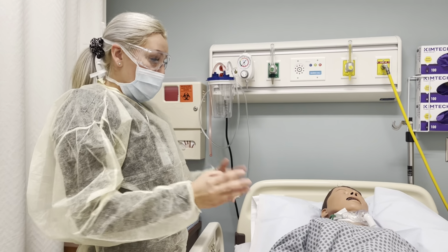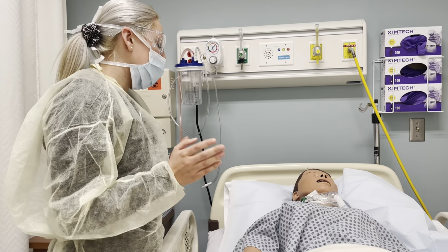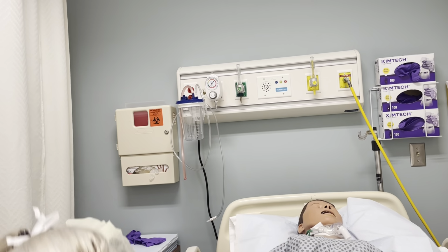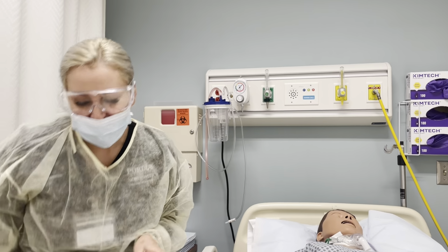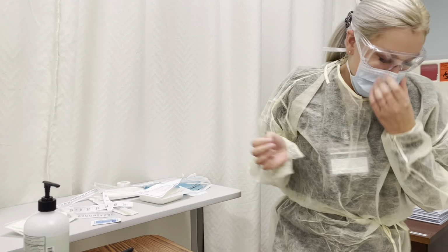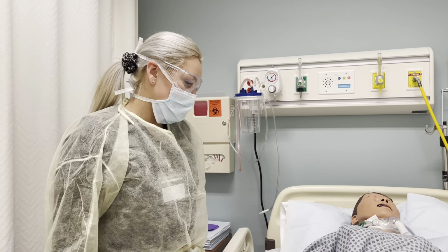What I'm going to do is I'm going to remove your old dressing and then apply a new one, and I'm also going to be making sure that everything looks okay, nothing's abnormal. So I'm going to make sure that I have my waste basket and then gather all of my supplies. And then I'm going to raise the bed to waist height or elbow height.